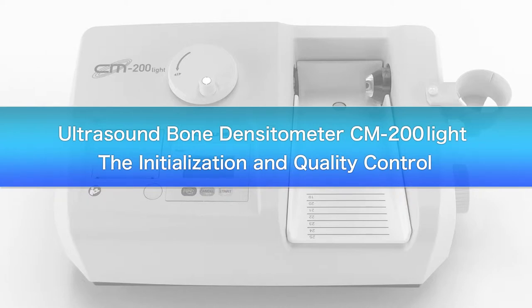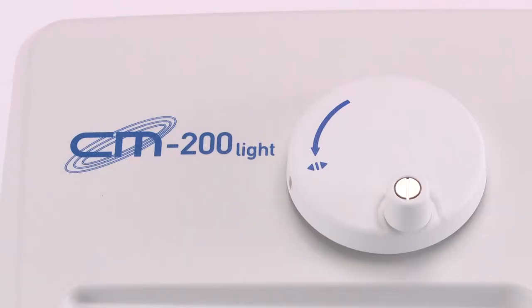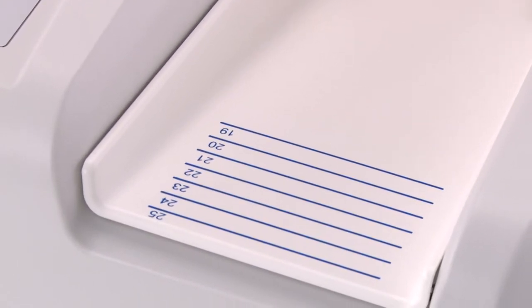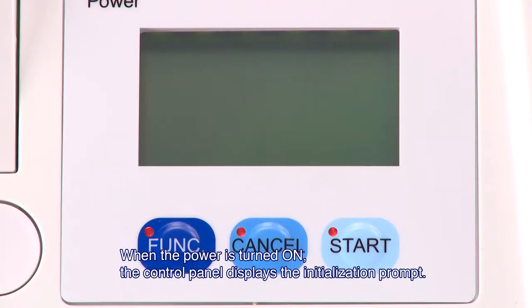We will now explain the initialization and quality control of the CM200 light produced by Huruno Electric Company. When the power is turned on, the control panel displays the initialization prompt.